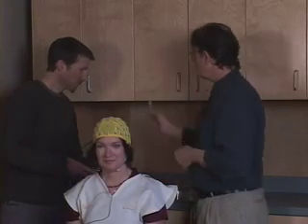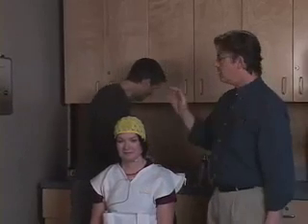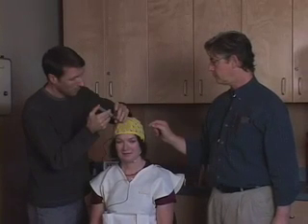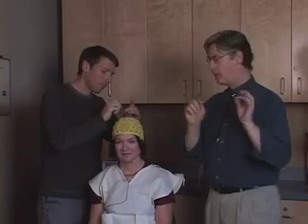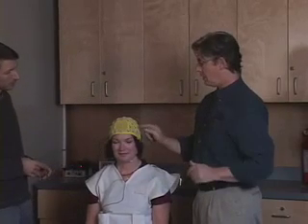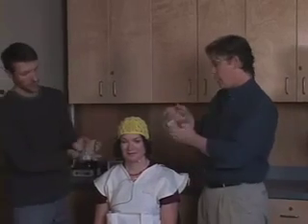Now at this point, what we do, as Ken is demonstrating, we get the gel and we place the gel into a syringe. Now what we need the gel for is to make a connection. It's a conductive gel, so rather than scraping the head, which is what used to happen with EEG, all we do is administer a little bit of gel, and this is going to then allow us to attach the electrodes in a way that will be sure to be able to get readings that we require. We now have the conductive gel in all parts of the cap, each individual location. So now what Ken and I can do is we can begin to attach the electrodes.